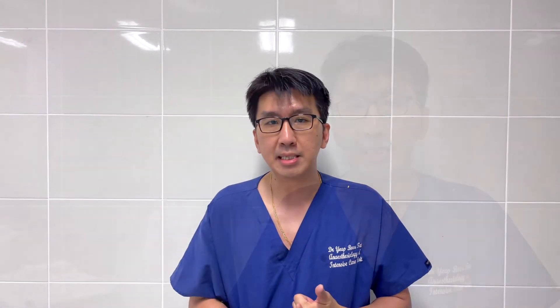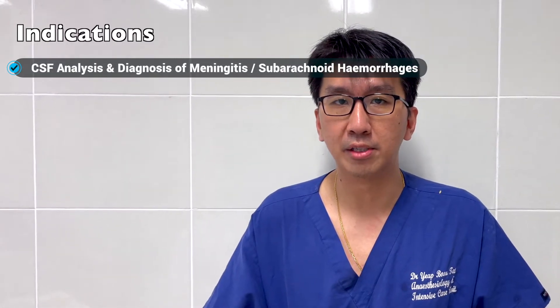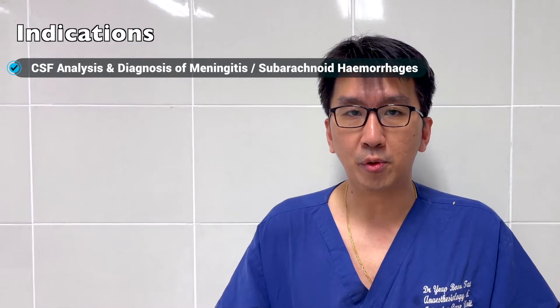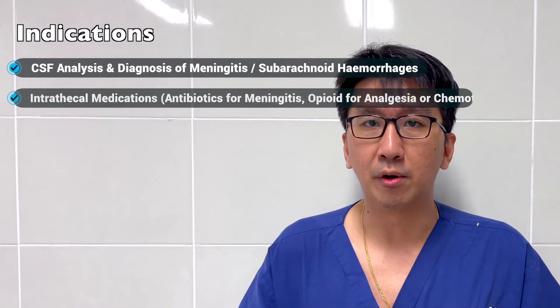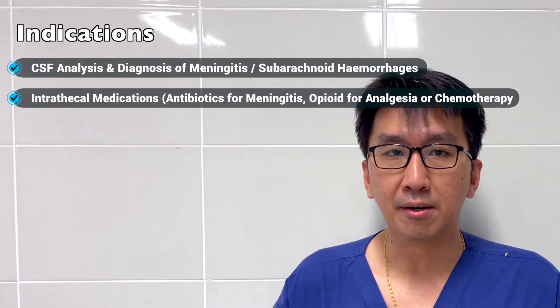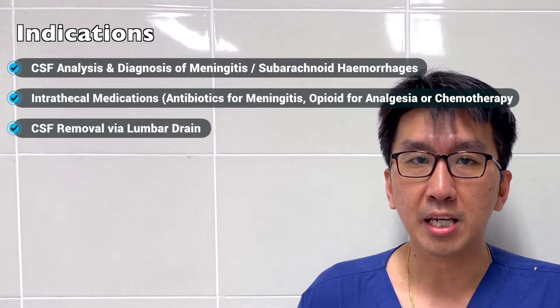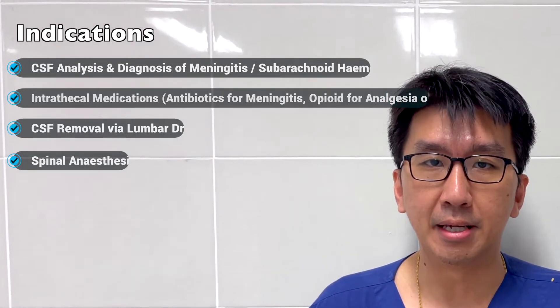Indications for lumbar puncture are: first, for diagnosis of meningitis, whether it's bacterial or viral in origin. Secondly, it's therapeutic, whereby we insert medication such as opioids or chemotherapeutic drugs. Thirdly, it's an adjunct to reduction of intracranial pressure with the usage of a lumbar drain.